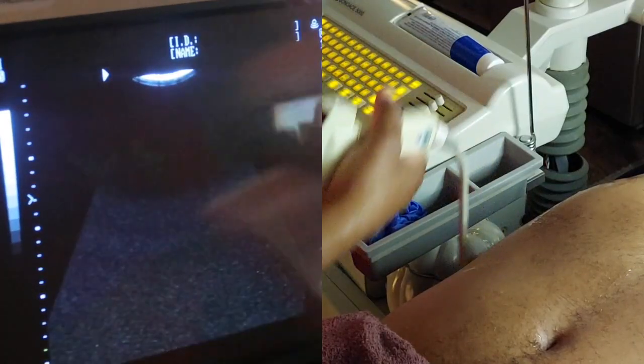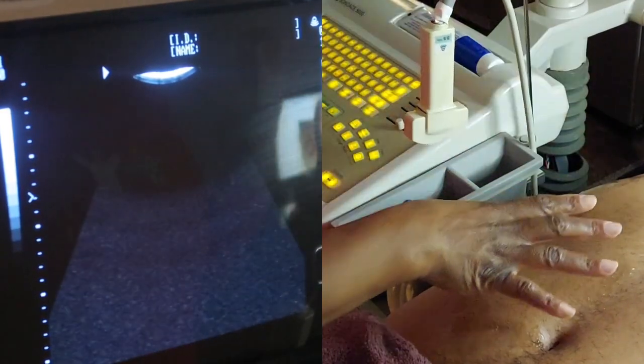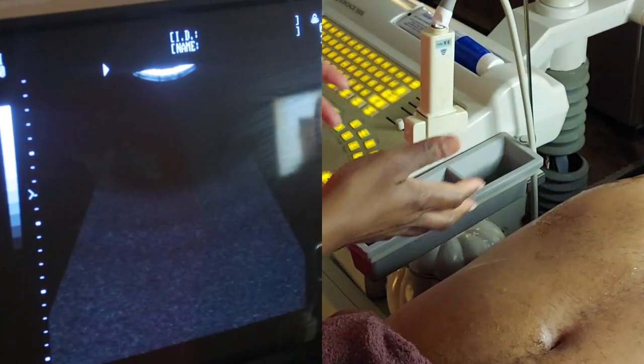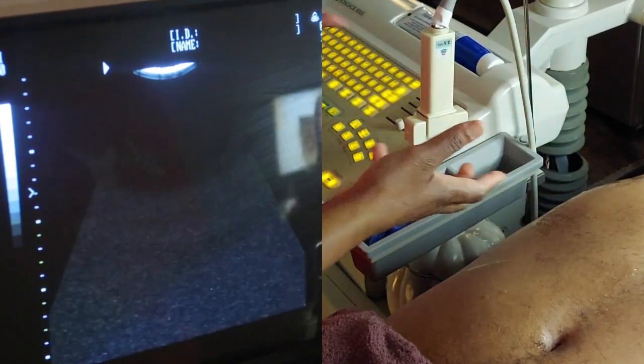Ask any question you want and I will definitely answer them for you, and if I don't know them, I will research them. Today's video is about ultrasound and how to remove rib shadow. So today we are going to be scanning a man's abdomen, liver right upper quadrant, only trying to teach you guys how to get rid of rib shadow and also find the best window for scanning.